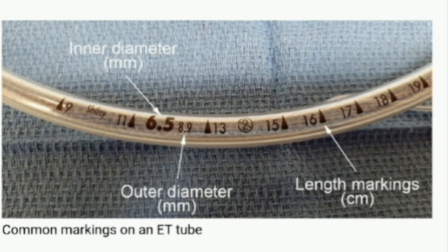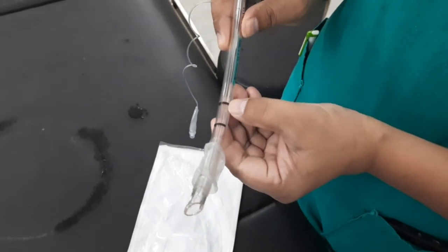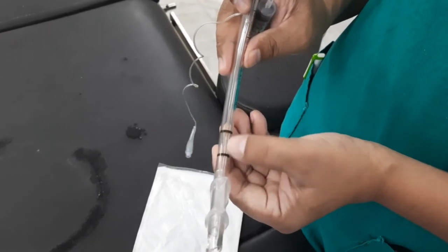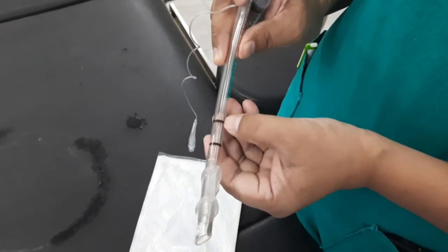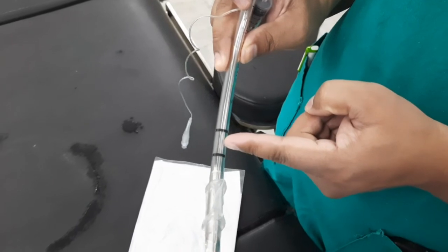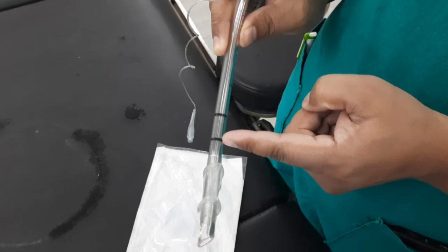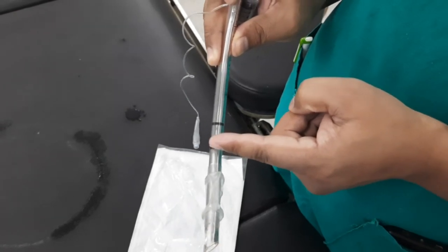An endotracheal tube that is too long for a given patient may be more prone to kinking and become obstructed; it can be cut to a more appropriate length if necessary. To help confirm correct depth of placement, some endotracheal tubes have black markings proximal to the cuff. The vocal cords should be at this black marking. If the endotracheal tube has two markings proximal to the cuff, keep the vocal cords between the two marks.